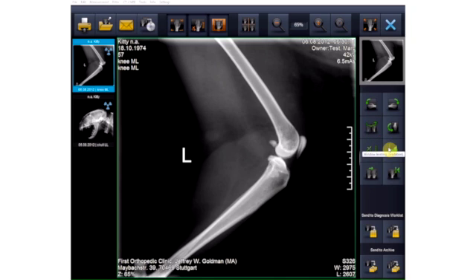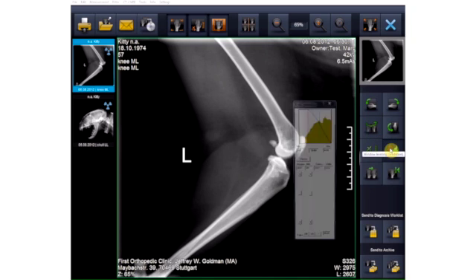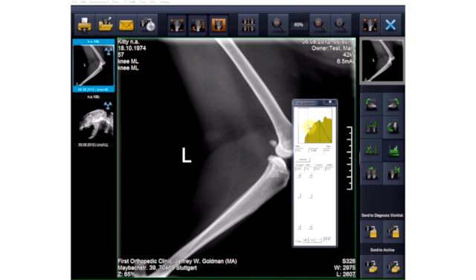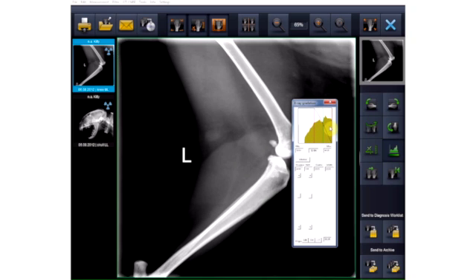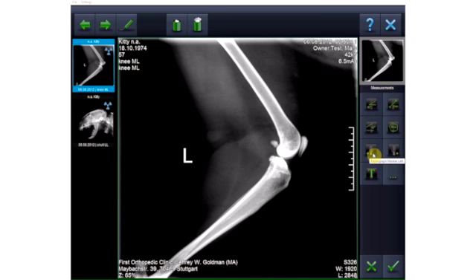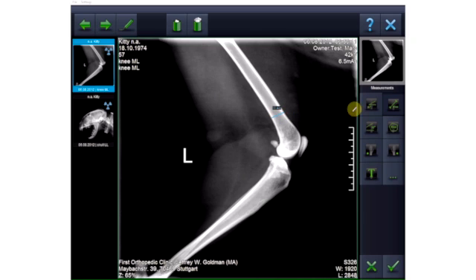If the images appear too dark or light, you can use the gradation tool to optimize them. Thanks to the available measurement functions, you can set angles, measure distance and outline, set X-ray markers, and add brief comments.